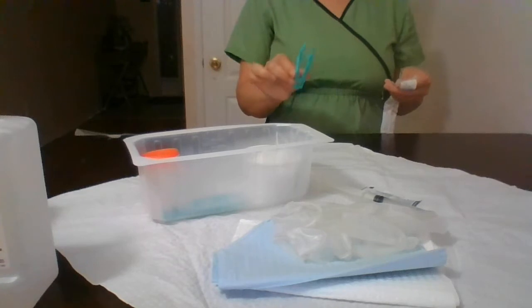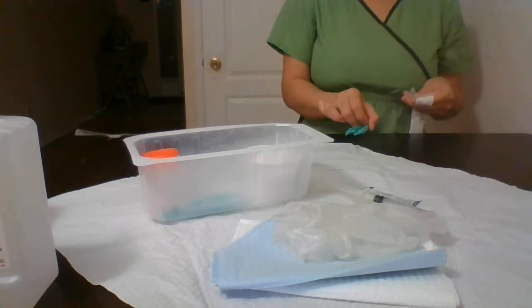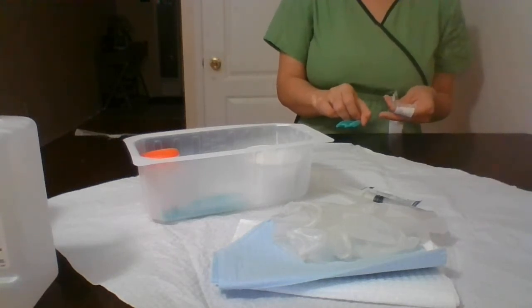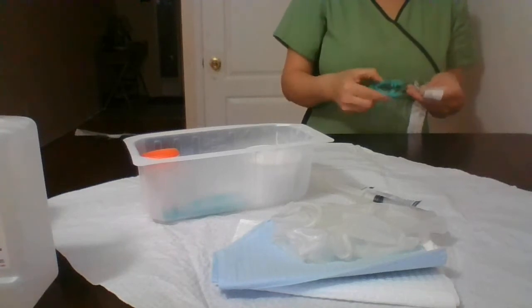I made sure that the tip of my forceps was placed within my sterile field, while the bottom did not have to be sterile. Unfortunately, you couldn't see the way I placed it there, but it was placed the right way.